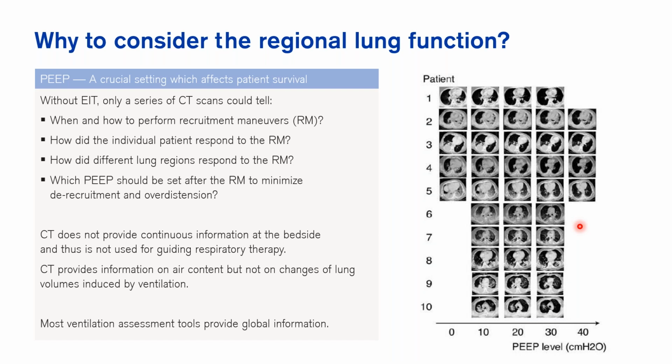But how many of you in your clinical practice have access to a CT scan during your recruitment maneuvers? Probably none. I would safely say none, because usually the CT is located somewhere in the basement, and the ICU is obviously located on higher floors.